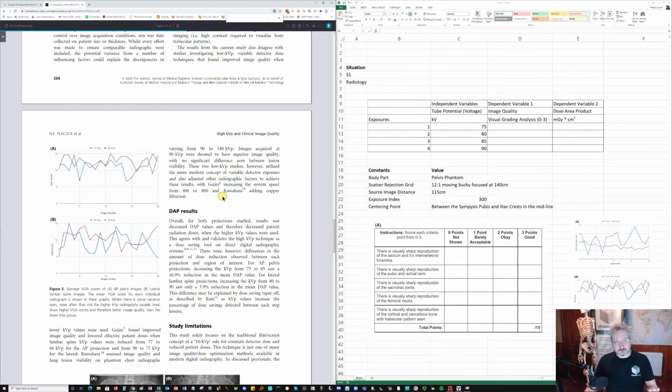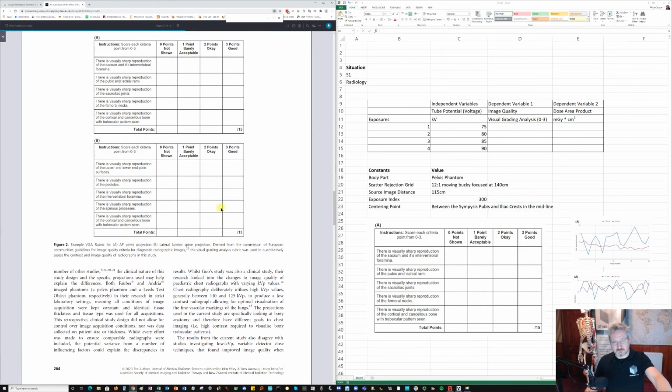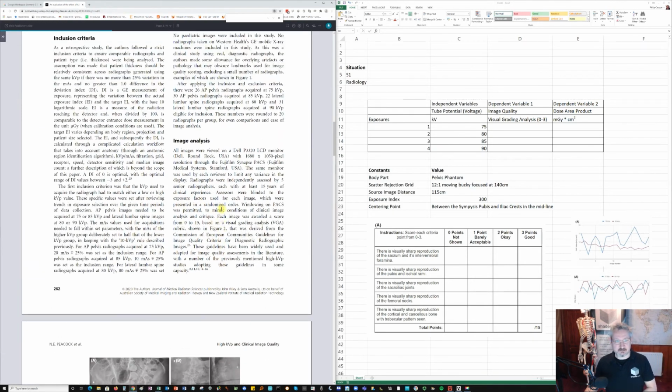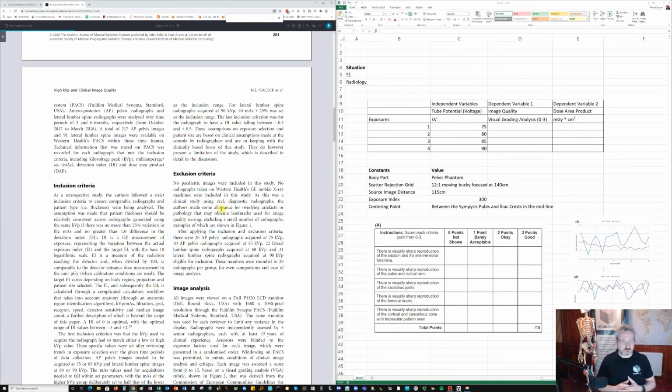So what I'll do now is I'll give this paper to the students a week before, ask them to read it and to have an idea about it. And depends on your learning methodology, I could do this and provide them a worksheet, like this, at the actual time and ask them to conduct the experiment. Or if I wanted them to do a bit more group work, I could get them to generate a worksheet like this themselves in a group and then talk about how they went about that and then conduct the experiment.